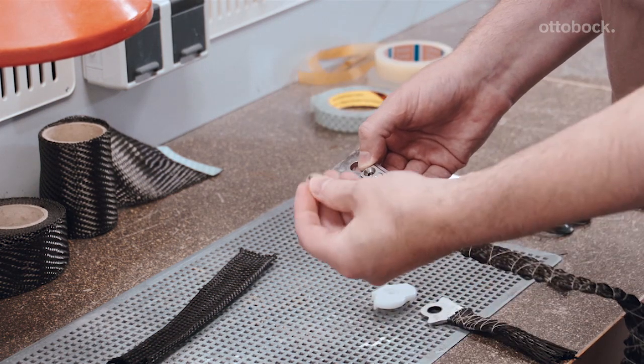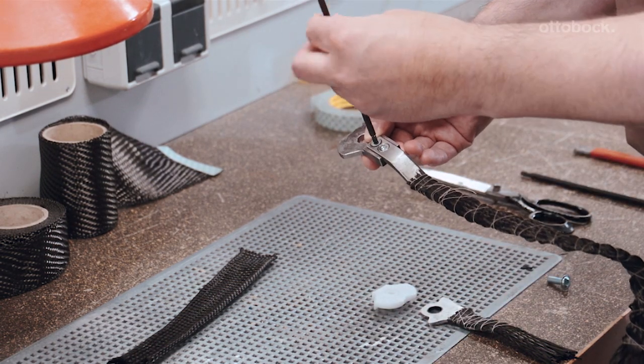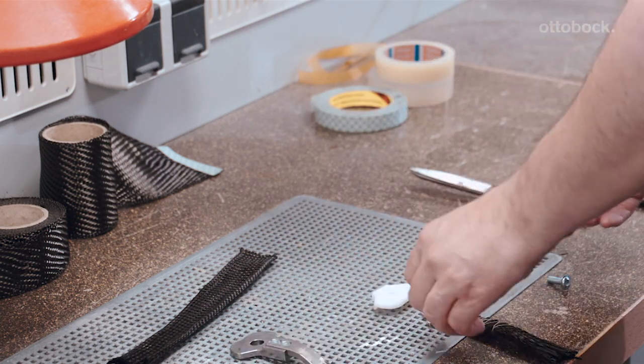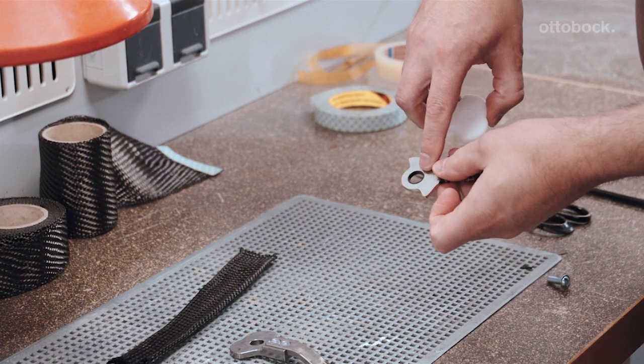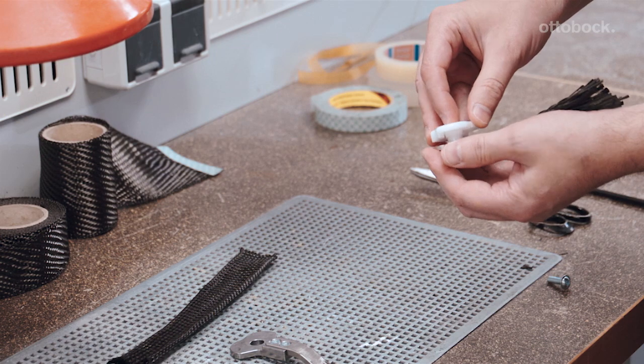Use the two screws to mount the carbon fibre reinforced bar component on the lower dummy section. The bearing bushing must be removed before the foot stirrup can be mounted on the dummy. Quick tip: the dummy cover can be used to easily push the bearing bushing out of the foot stirrup.